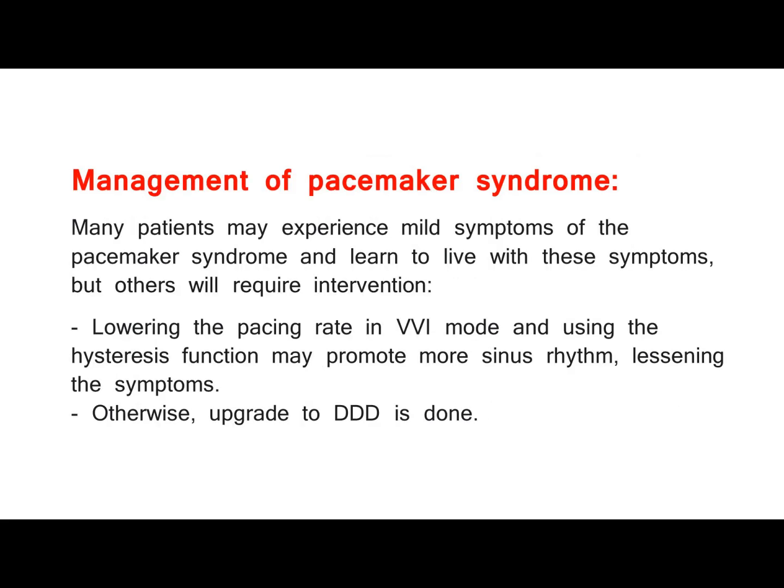Management of pacemaker syndrome. Many patients may experience mild symptoms of the pacemaker syndrome and learn to live with these symptoms, but others will require intervention. Lowering the pacing rate in VVI mode and using the hysteresis function may promote more sinus rhythm, lessening the symptoms. Otherwise, upgrade to DDD is done.